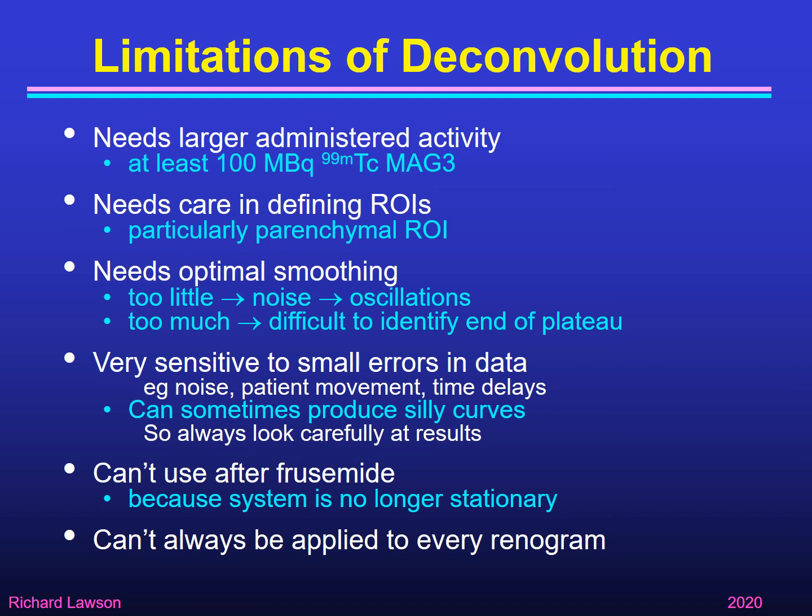But in Manchester, our routine doesn't include deconvolution as the standard. If we're trying to diagnose PUJ obstruction, we prefer to use diuresis renography, which is the subject of another talk in this series.